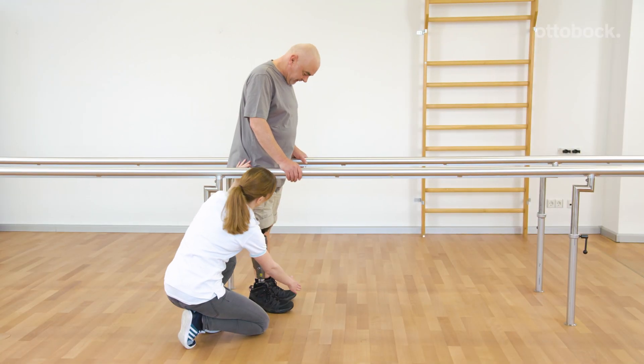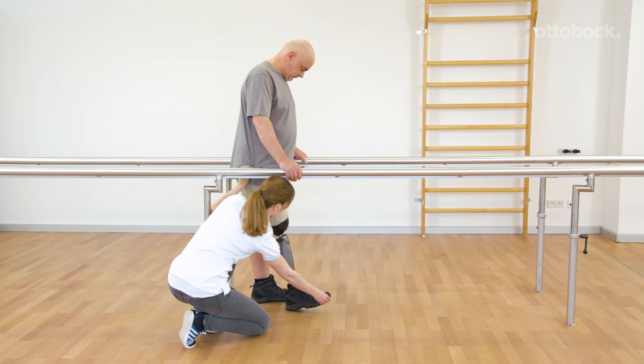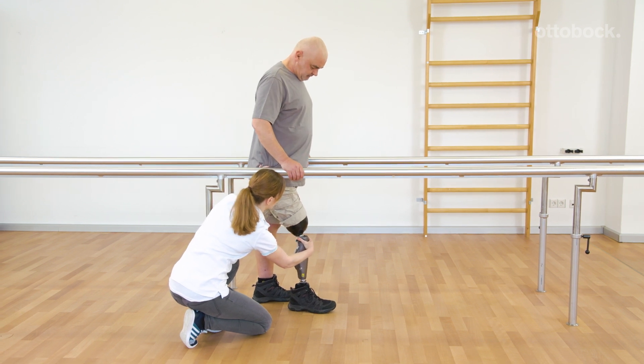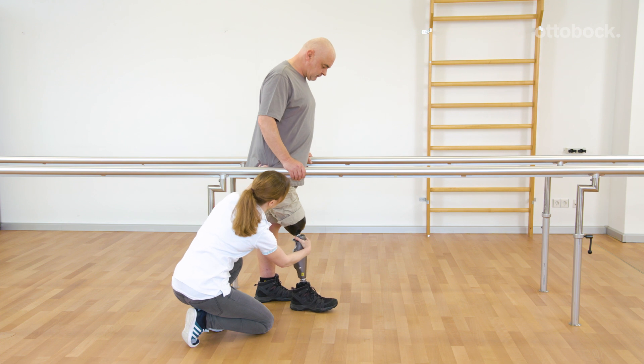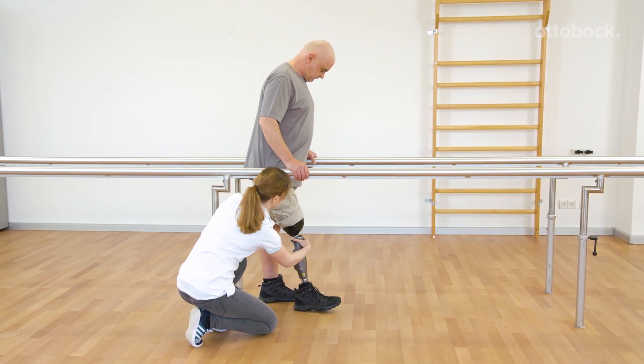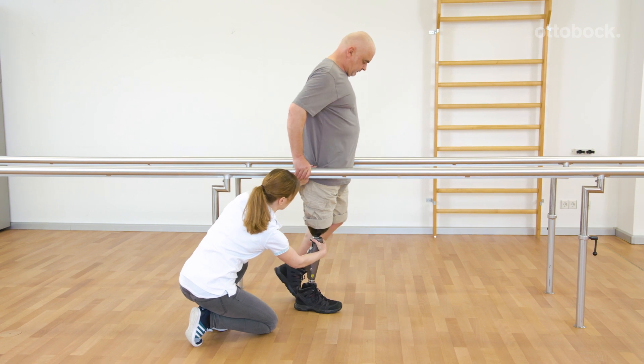When observing physiological gait, the knee joint bends slightly during initial contact and loading response. This movement serves as a shock absorber, relieves the musculoskeletal system, and provides safety through a faster foot-flat position.